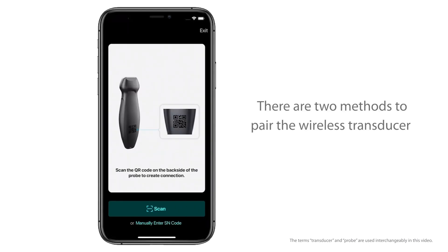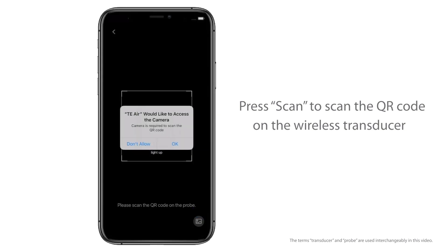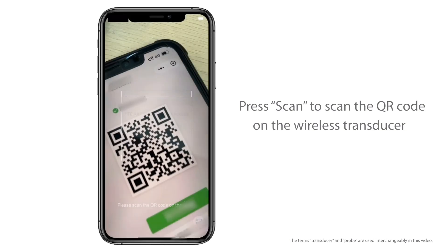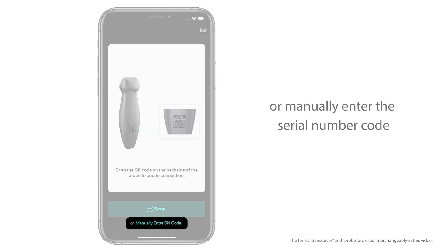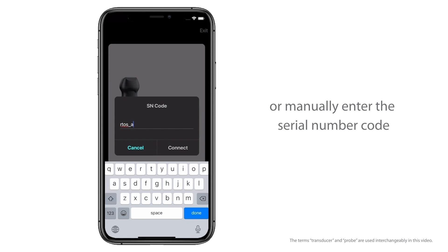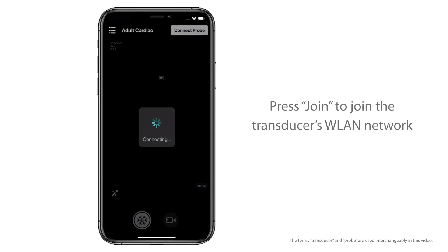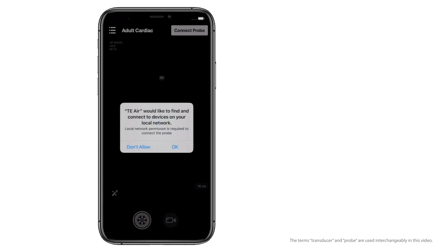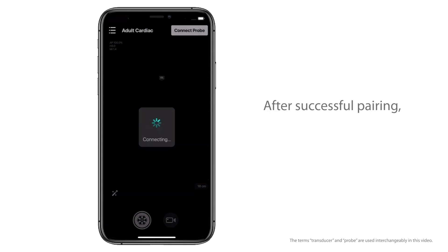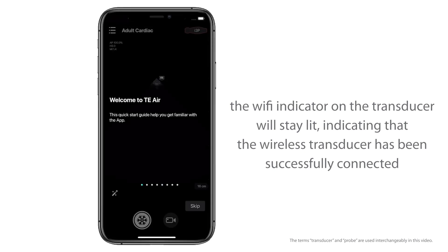There are two methods to pair the wireless transducer: press Scan to scan the QR code on the wireless transducer, or manually enter the SN code. Press Join to join the transducer's WLAN network. After successful pairing, the Wi-Fi indicator on the transducer will stay lit, indicating that the wireless transducer has been successfully connected.